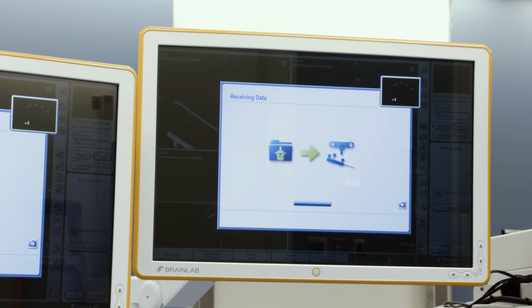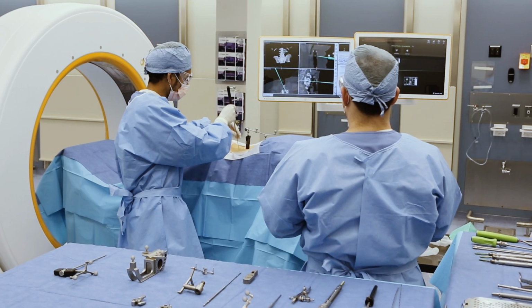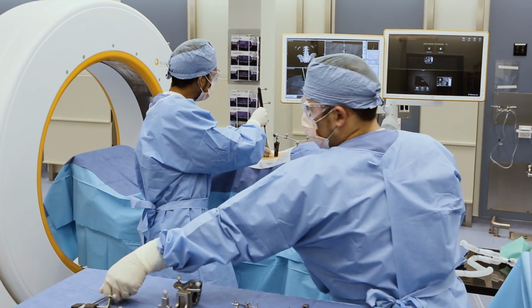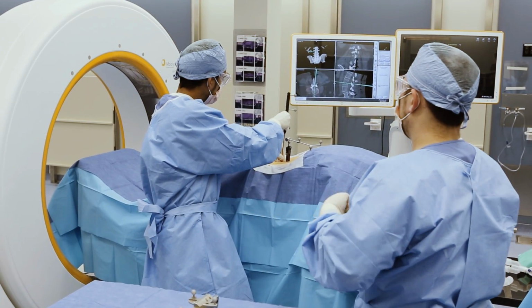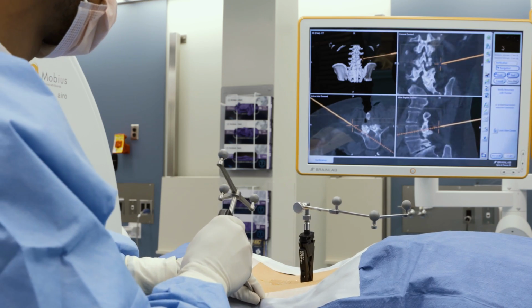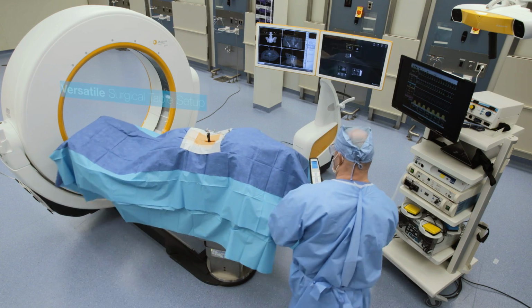and we would be ready to implant screws. It's important that you check with the pointer on known anatomic landmarks and make sure that it is as accurate as you want, and then reposition the table to the operative position. You're ready to operate and insert screws. And again, on average, it takes 6 to 8 minutes.